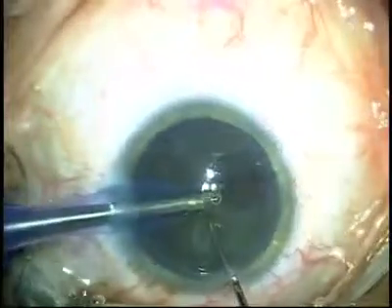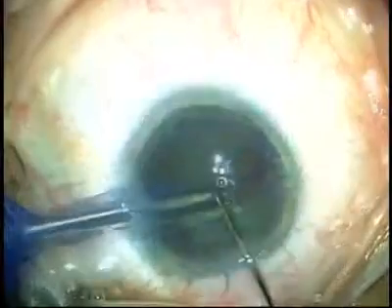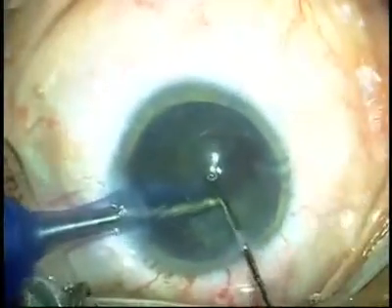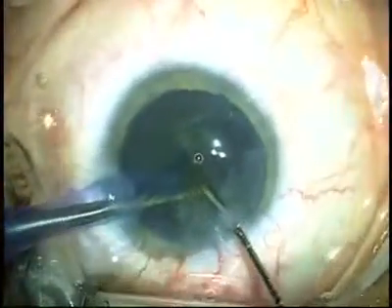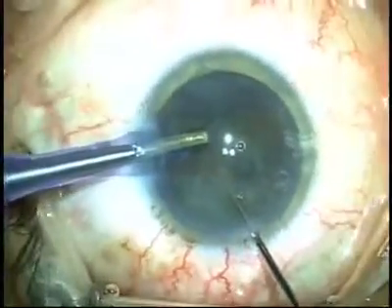Deep coring of the nucleus is done here along with cracking. Once this is done, the pieces are brought up in the anterior chamber very carefully, and you can see a very nice bounce in the area illustrated by these arrows.